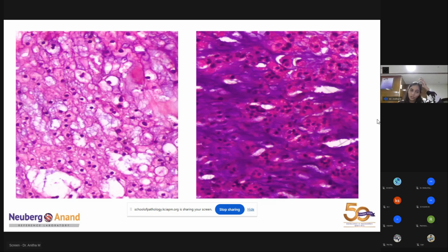As you described, the tumor is composed of two components. One is very large epithelioid cells, not that pleomorphic but heterogeneous, somewhere low grade, somewhere showing high grade, with abundant eosinophilic cytoplasm arranged in cords, small nests, and individually. The other component has vacuolated bubbly cytoplasm, what you called physaliferous cells.